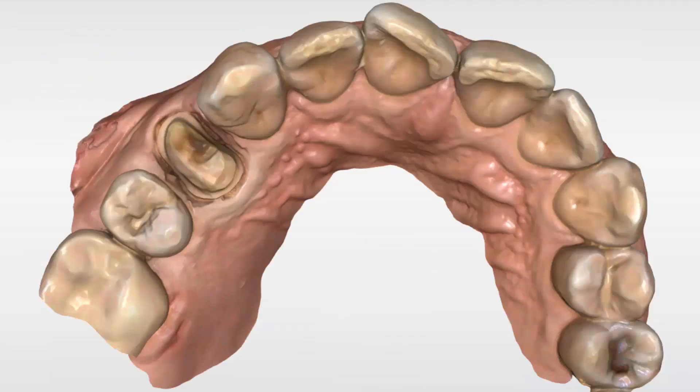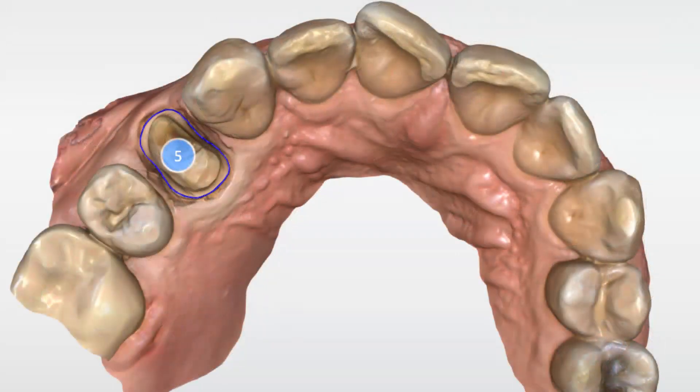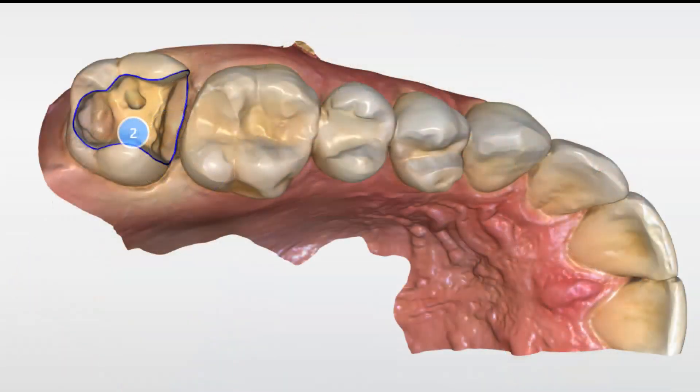The PrimeScan has the ability to capture margins crisply and accurately even in subgingival situations. This would be fantastic alone except for the fact that the CEREC-5 software finds them automatically almost every single time. You don't need color, tools, or different intensities when the software does it for you perfectly — even in extremely tight situations like partial coverage on second molars, the software operates seamlessly identifying the margin.